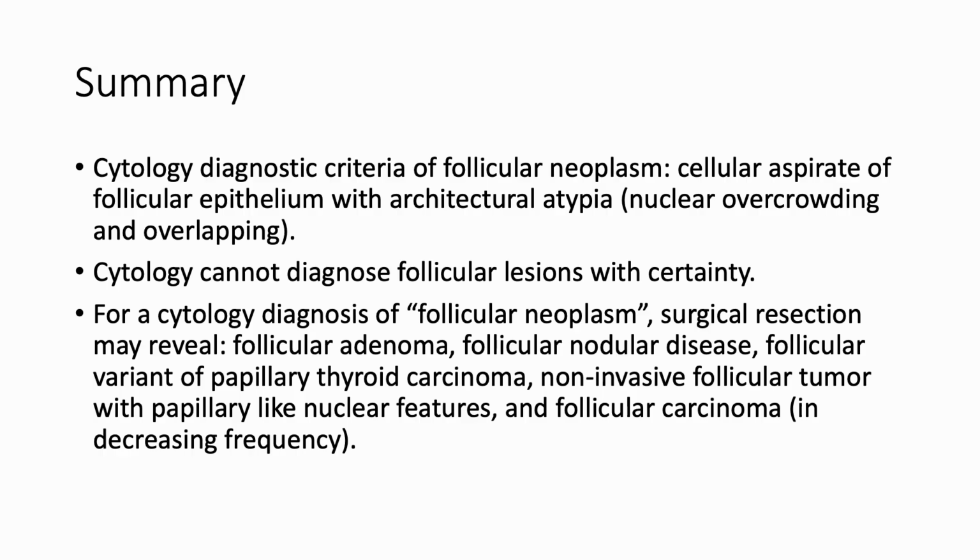However, since cytology cannot evaluate the presence or absence of a capsule or invasion, cytology cannot definitively diagnose follicular lesions. A cytologic diagnosis of follicular neoplasm may correspond to various entities upon surgical resection, including follicular adenoma, follicular nodular disease, follicular variant of papillary thyroid carcinoma, NIFTP, follicular carcinoma.